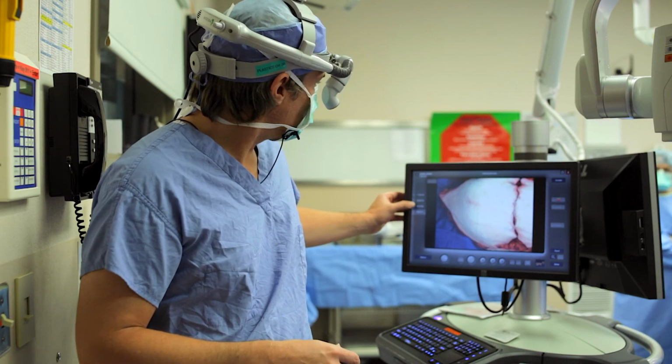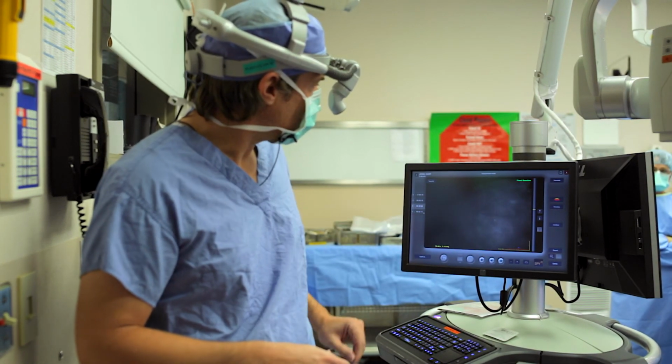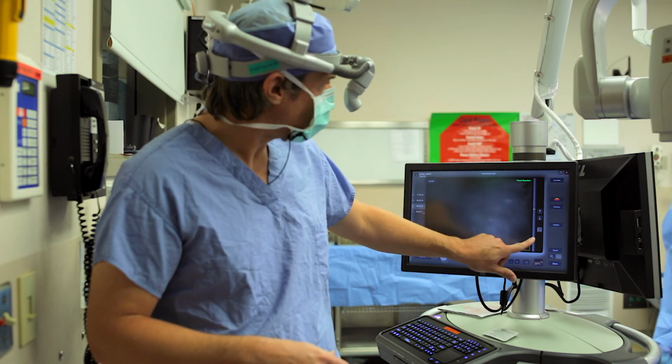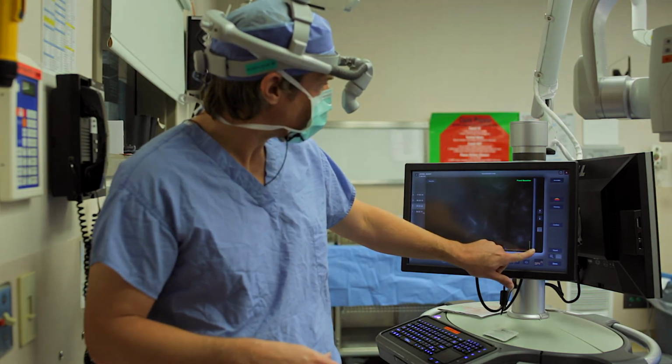So I can bring in the information. I'm going to tap on the SPY images that we obtained, and we're going to take a look at what that looked like in real time.